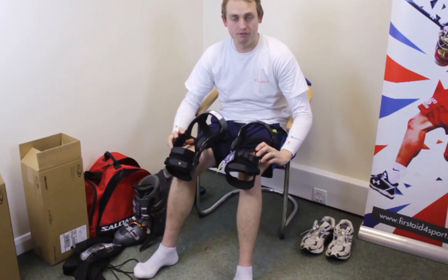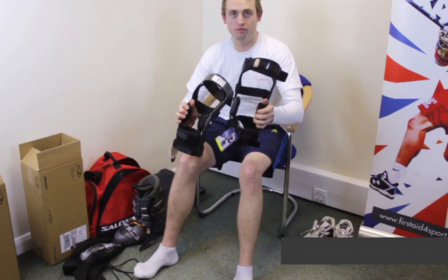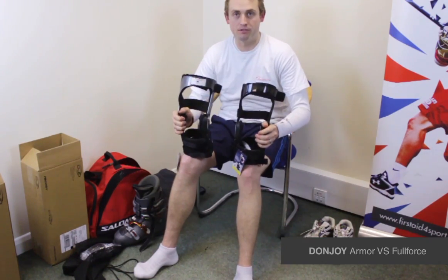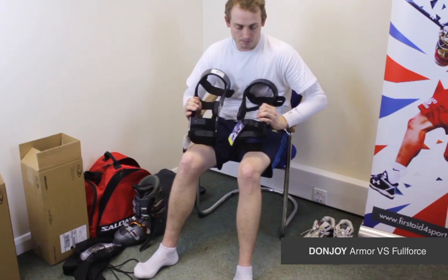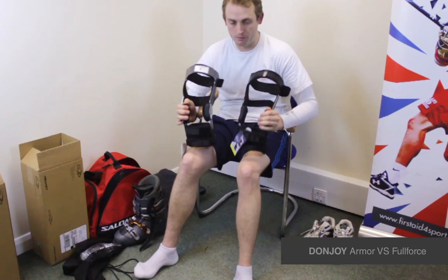I'm Michael Babison, Managing Director of First Aid for Sport, and these are the two Donjoy braces. We've got the Full Force and the Armour, and a lot of people have been asking us the difference between the two braces, because for us it's ski season, and these are two incredibly popular braces.